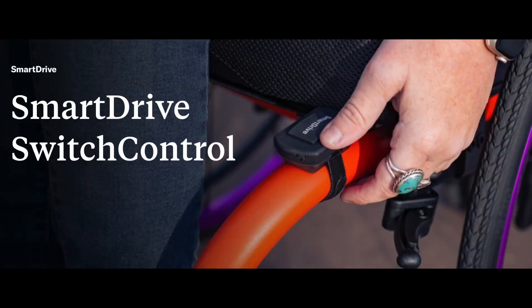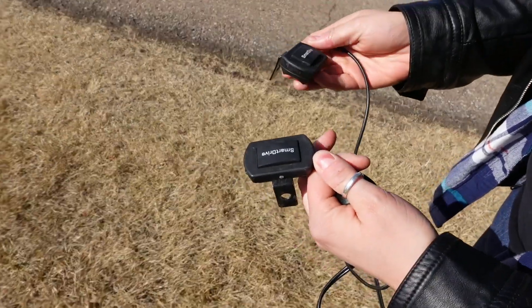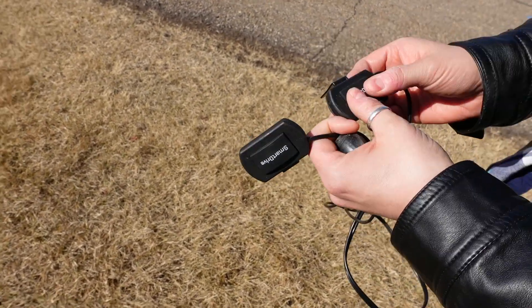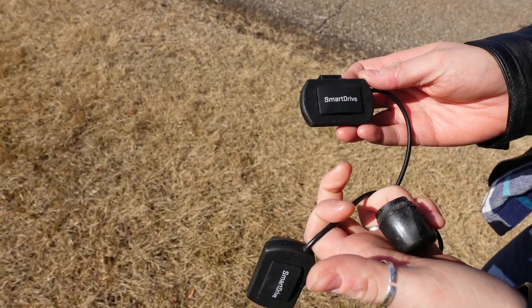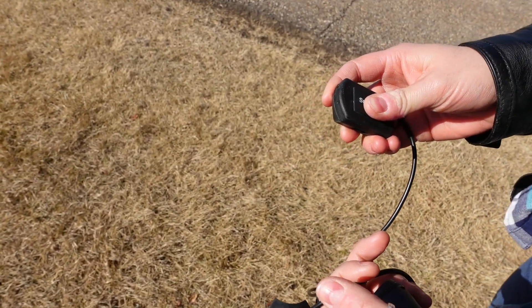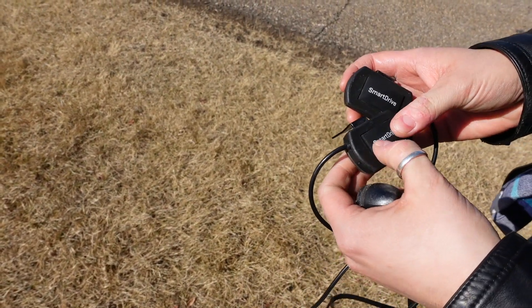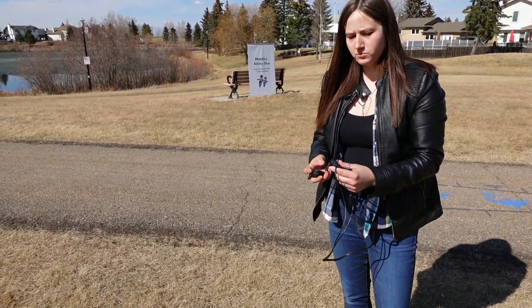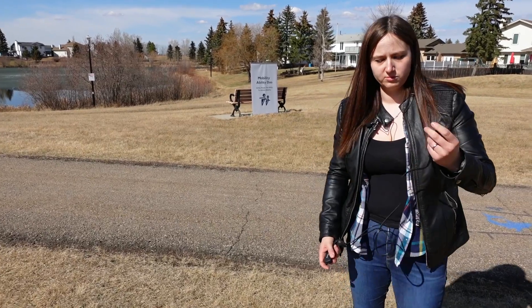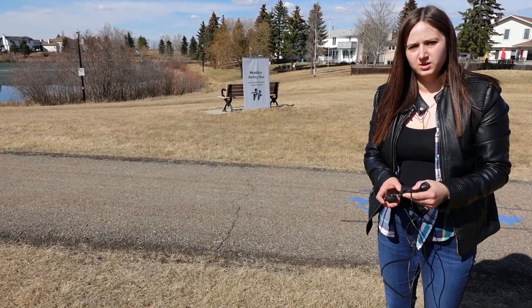So these are the smart switches — there's three different types. The only thing with these is, in order to drive, you have to hold in on this button here. So you hit the button and hold it, so it's not really ideal all the time. You have another option where you double-click it and that kind of locks in your speed — you can latch it. So it just goes automatically and then you've got to hit it again if you want it to stop.